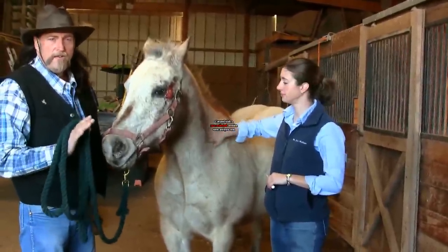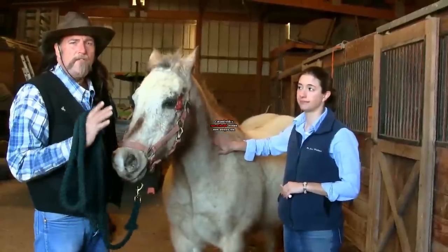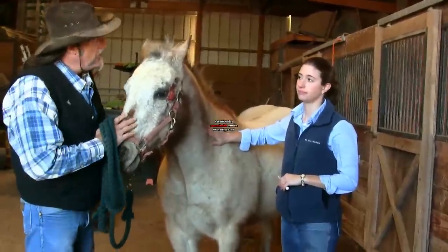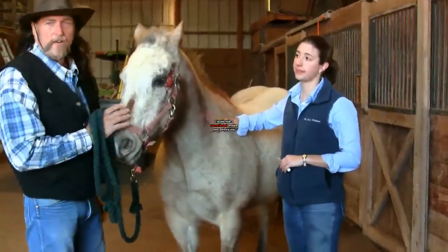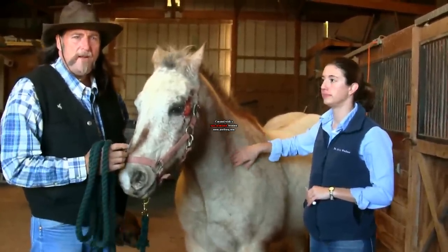Brand new needle, brand new syringe. This is Dr. Erica Wallace, and we're going to show you what it's like to give a horse a very simple injection in the muscle. IM is in the muscle; IV means intravenously, in the vein.